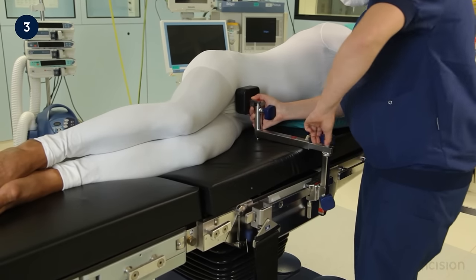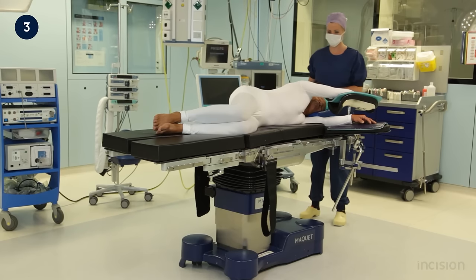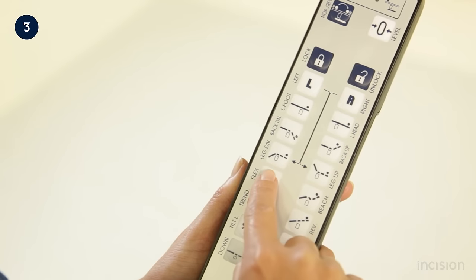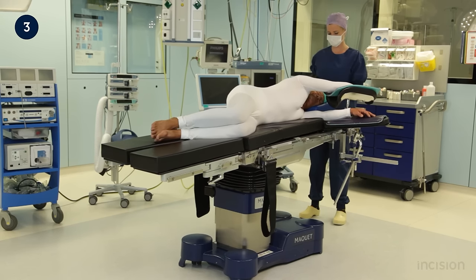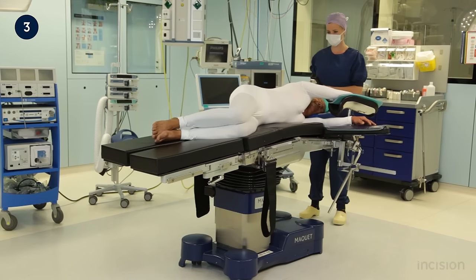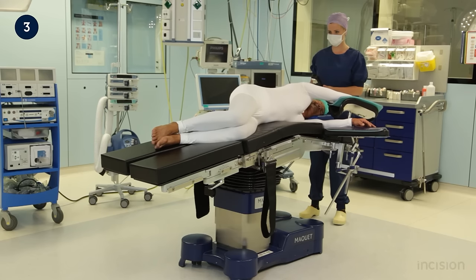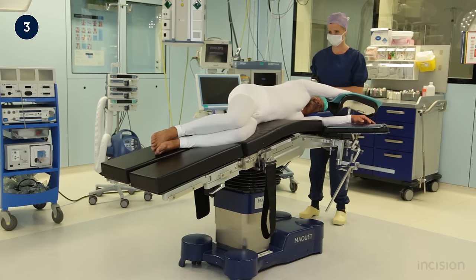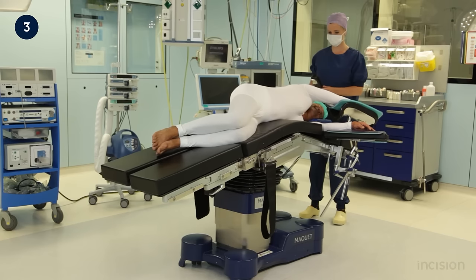Movement of the table into certain positions can be programmed to occur with the push of one button. For example, the kidney position, where the middle of the table is flexed. Keeping the button pushed results in alternating movements that bend the lower back plate. These slow, pre-programmed movements allow the patient to be positioned safely without injury. Once the required degree of table flexion is reached, the button is released and the movements stop. As with the lateral position, body supports may be required to maintain the patient in this position.